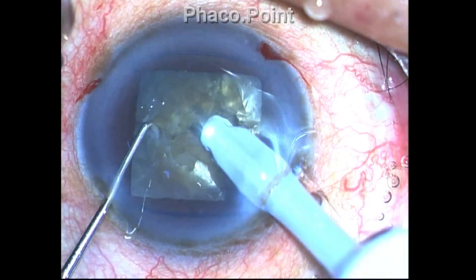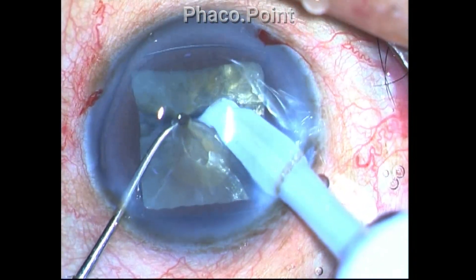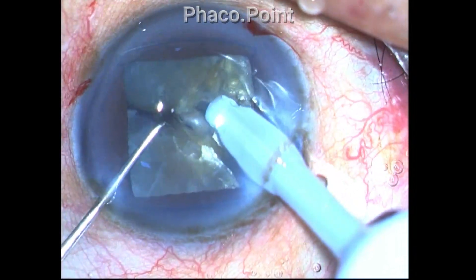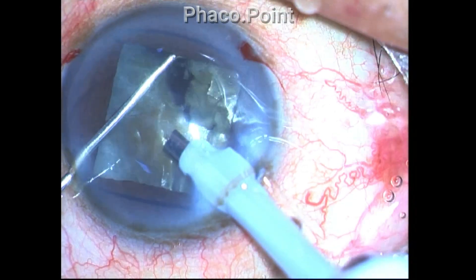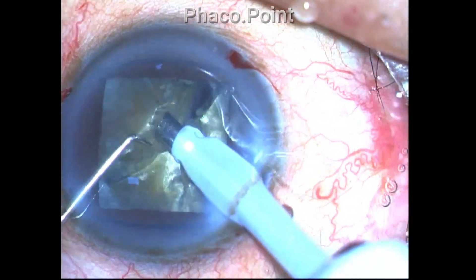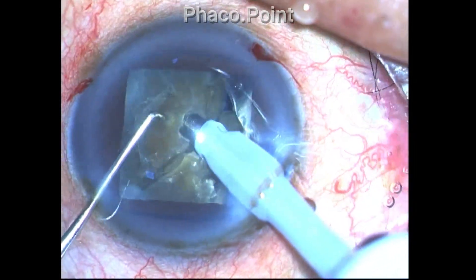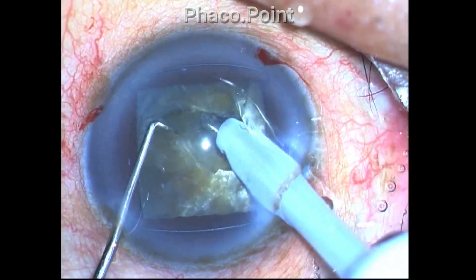The important thing is to achieve a breakdown of this large nucleus into sufficiently smaller fragments so that it will facilitate the mobilization of the fragments through the capsulorexis and help you bring them to the safe zone in the center to emulsify the fragments.